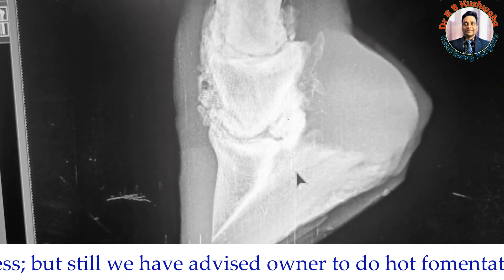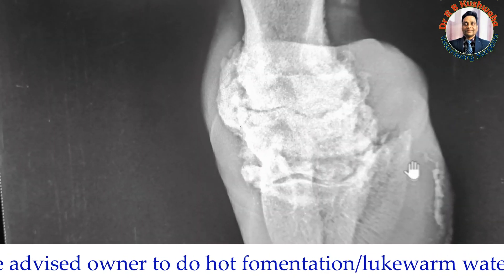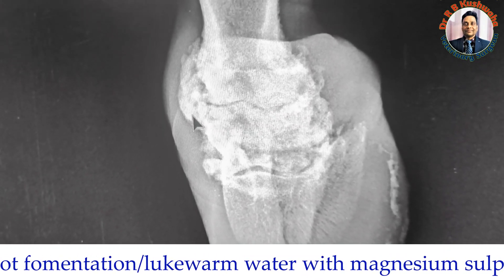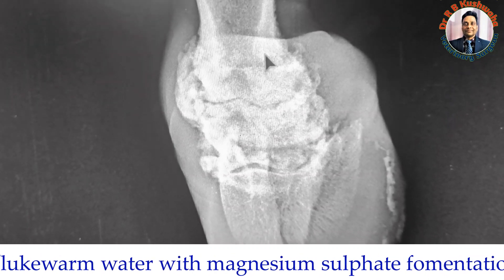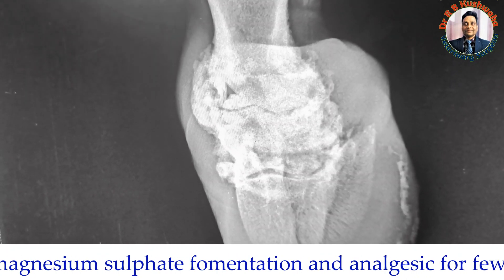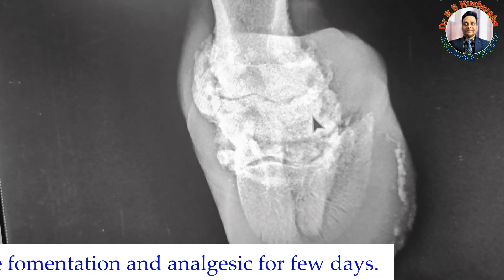This was the lateral view. In the craniocaudal or anterior-posterior view, you can also see a lot of osteophyte formation around the articular surface as well, meaning there is significant articular osteophyte involvement. Overall this is a very complicated case, and we advise the owner not to keep much hope.